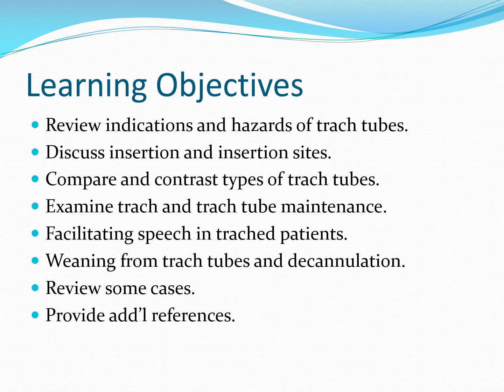We'll also broach the topic of facilitating speech in tracheostomized patients. Furthermore, we'll discuss weaning from trach tubes with the eventual goal of decannulation. And decannulation is a fancy term for the removal of the tracheostomy tube in a planned and controlled manner. We'll also review some case studies, and in addition, I'll provide you guys with additional references and resources for those who want to drill down more and learn more about this topic.